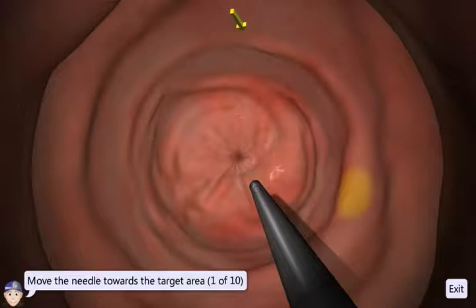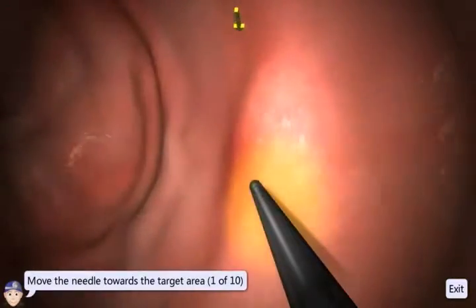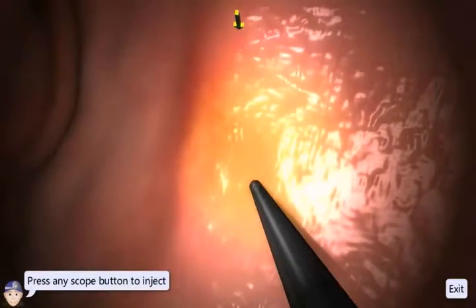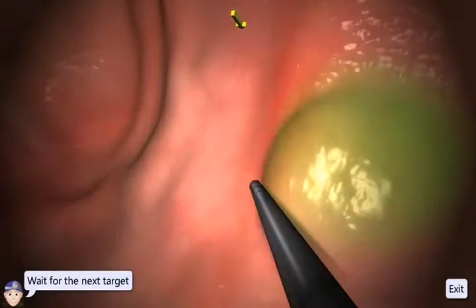The object of this exercise is to inject solution into the highlighted areas of the cavity wall. Simply bring the instrument up to the edge of the wall, insert the needle fully, and press any button on the hardware to inject.